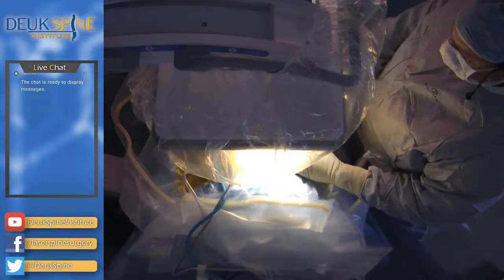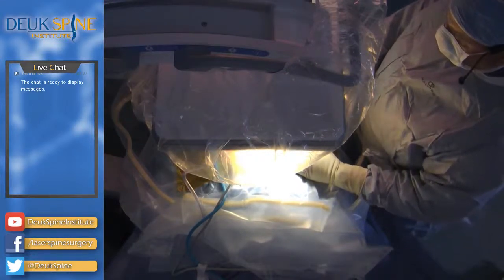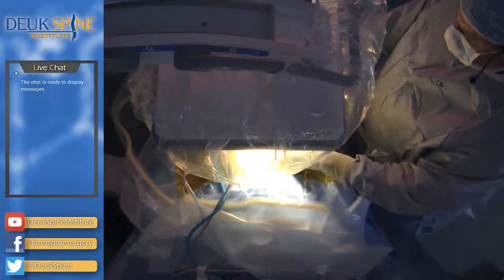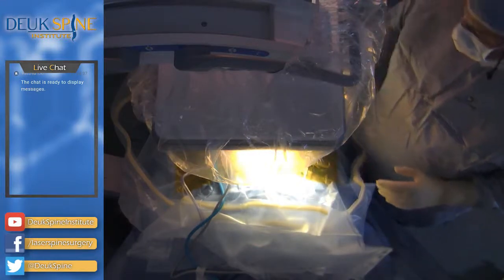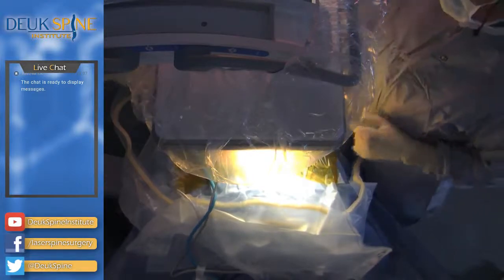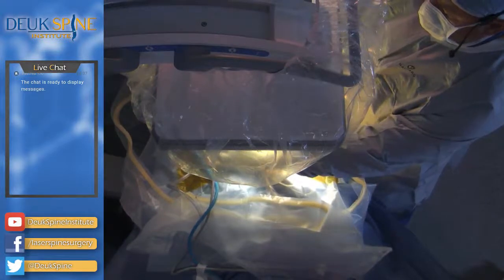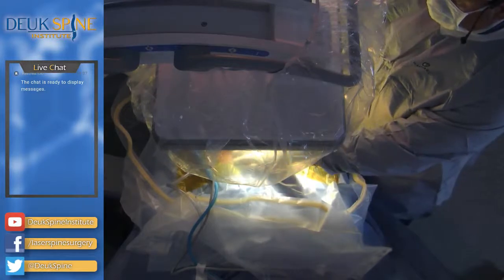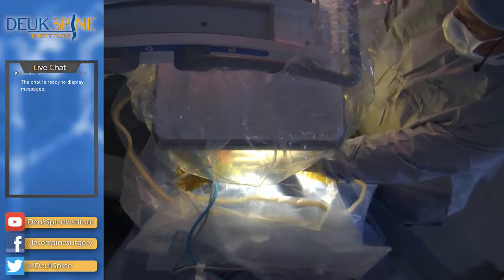I apologize. Do we try any bicarb? No, this one, sir. Next time? Yes, sir. All right, he said it was a 10%. Yes, right, 10% bicarb? And left, we said, was 4-5, 5-1. Right is 3-4. Is that correct? Yes, sir. Right? We're all in agreement? Okay, so our patient, we're going to be fixing 3 discs.